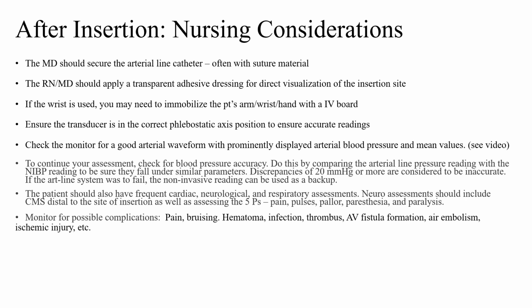But it's important that you continue your assessment. We're checking for blood pressure accuracy. Again, this is comparing the arterial line with a blood pressure cuff monitor, and we want to make sure that there isn't a huge discrepancy there.